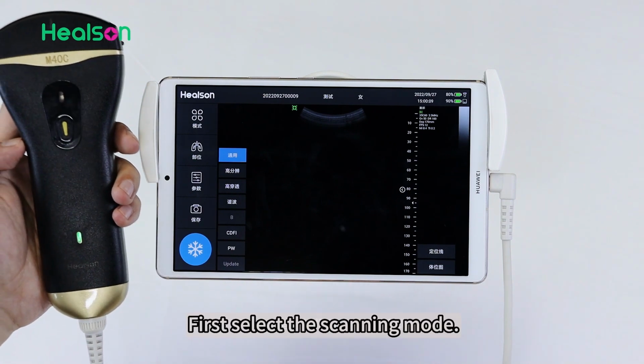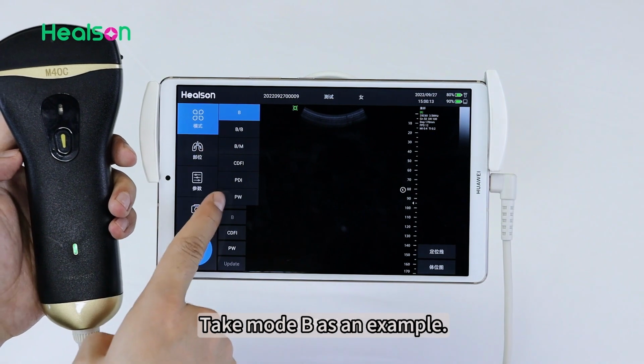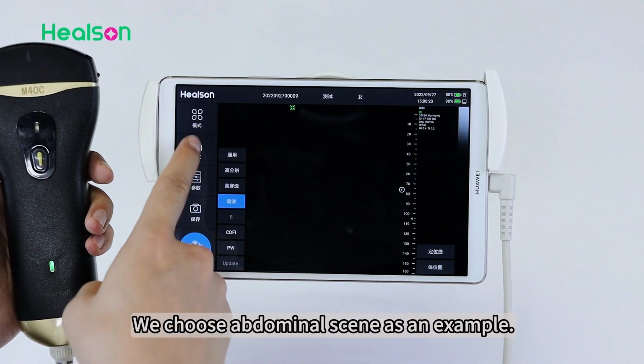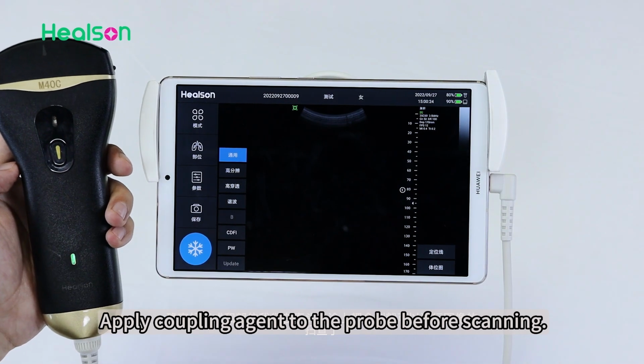First, select the scanning mode. Take mode B as an example. Select corresponding part. We choose abdominal scene as an example. Apply coupling agent to the probe before scanning.